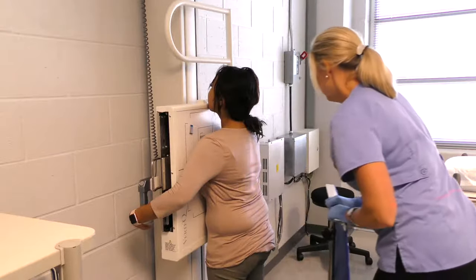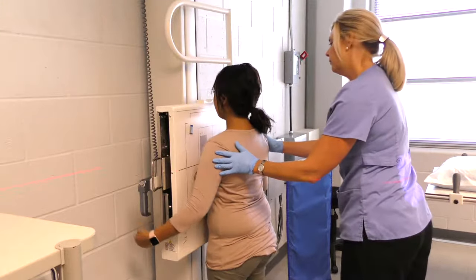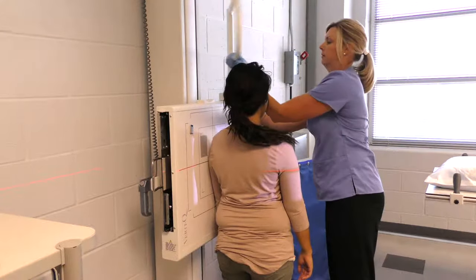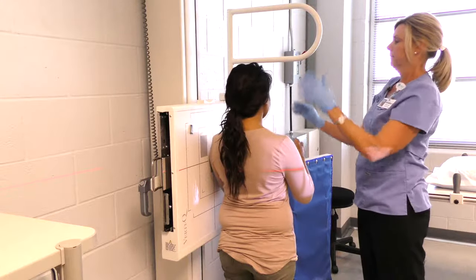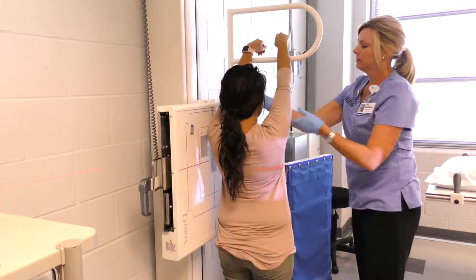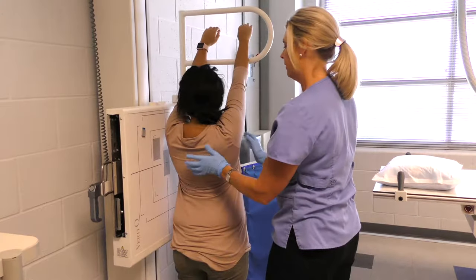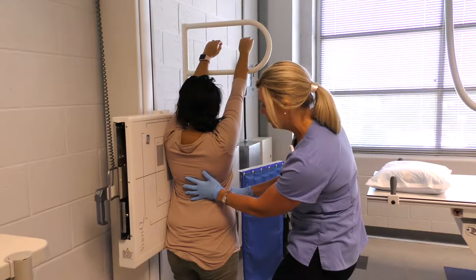Alright, Vanessa, I'm going to have you turn around and put your left side against the board. Raise your arms and grab — there you go — as high as you can. Great. Just going to move your ponytail a little bit and place your left side as close as you can to the board.